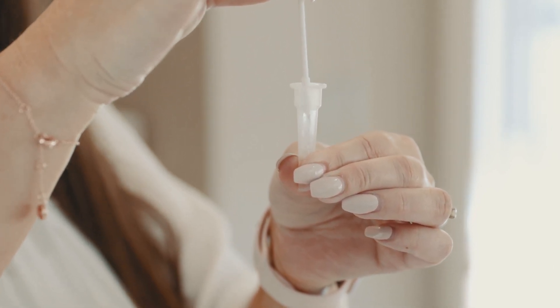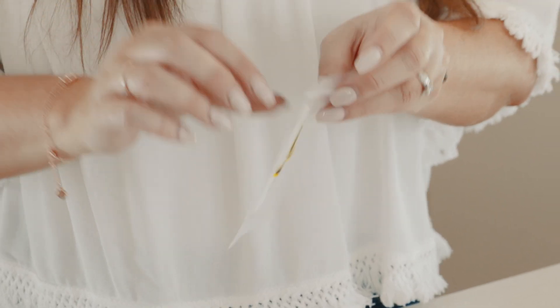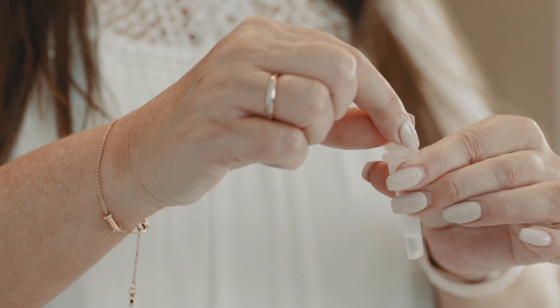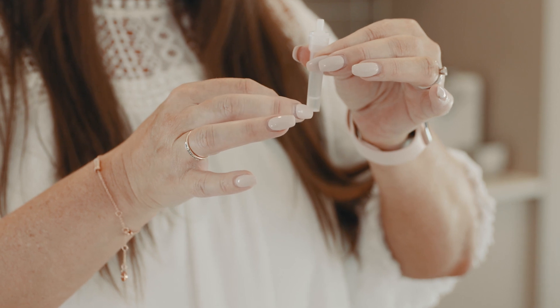While still squeezing the tube, remove the swab and then place it into the waste bag. Attach the cap firmly onto the extraction tube and mix thoroughly by swirling or gently flicking the bottom of the tube.